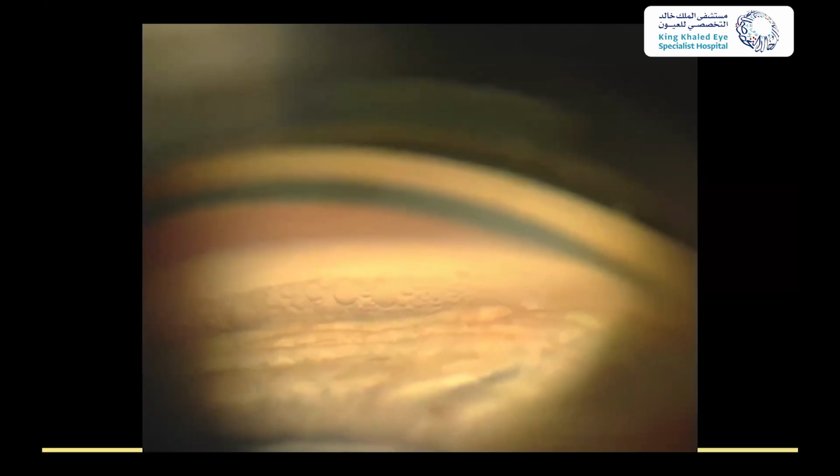This is somebody with bubbles in the angle. People always get the silicone, but it's the wrong angle because of gravity. So this is perfluorooctane in the angle. And this is a patient with spherophakia. So angle closure in the face of high myopia, you should be thinking spherophakia. It's a bit like a volcano. And this is what they look like dilated.